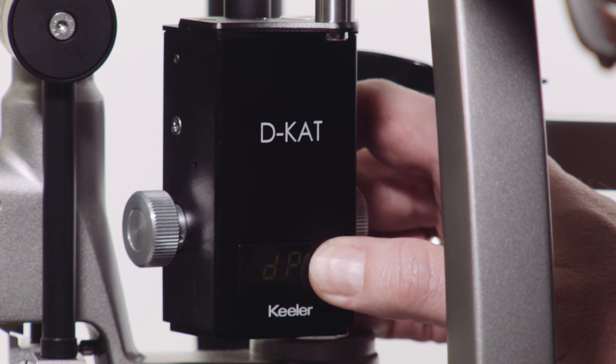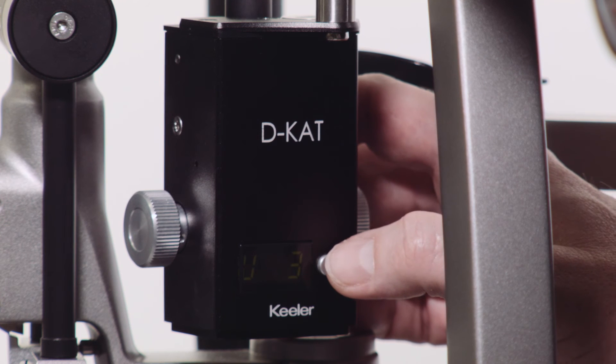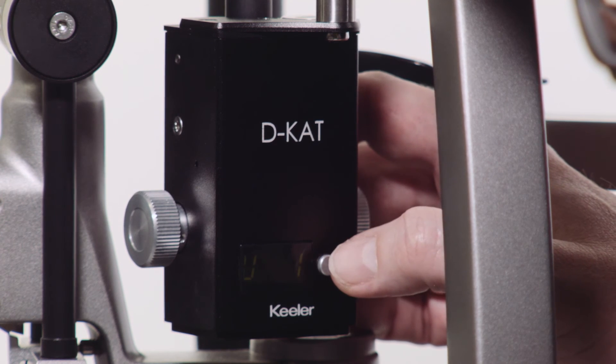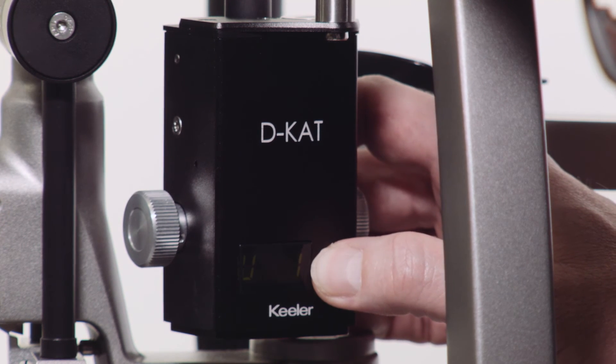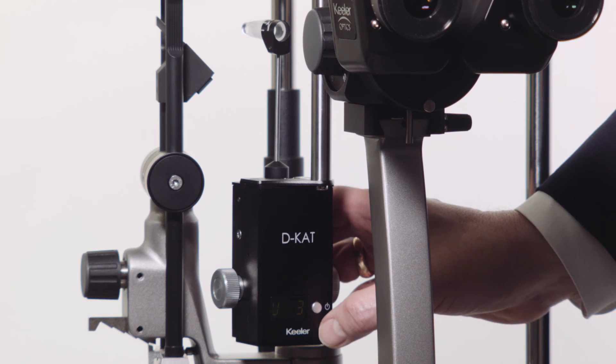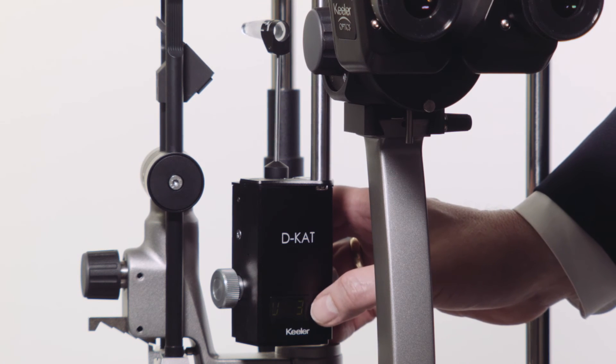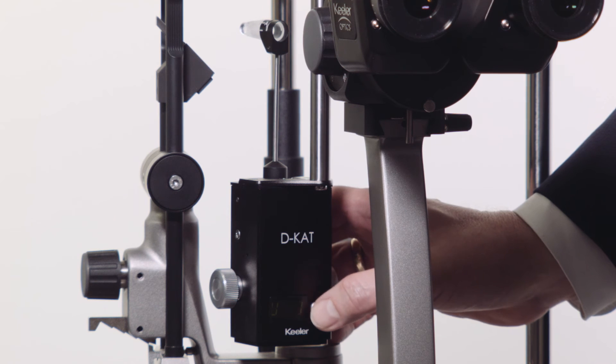Volume can also be set by pressing the function button for more than three seconds and then again for three seconds once D-P is displayed. V will be displayed and the function button can be used to toggle between volumes 0, 1, 2, and 3.